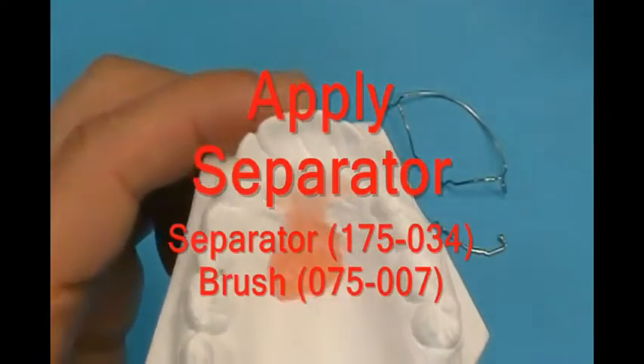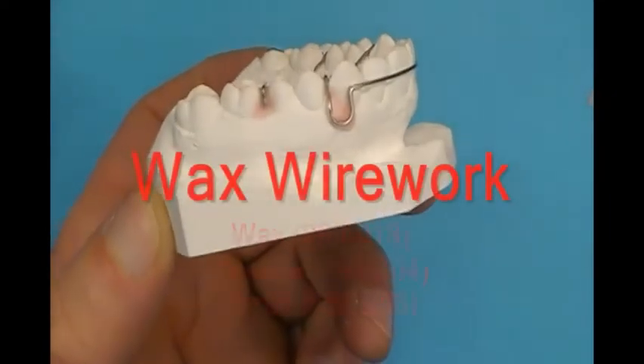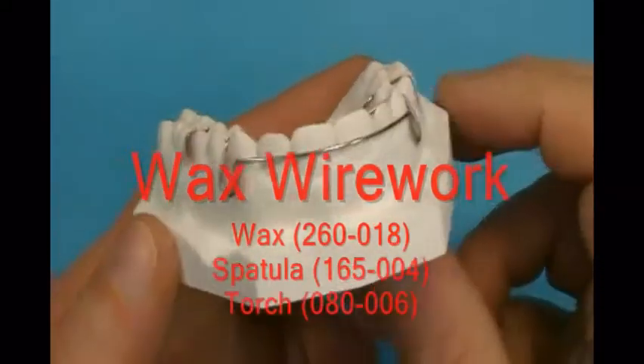Apply liquid separator to the model, except along the facial surfaces where the wires will be waxed in place. Apply wax facially over the wires to hold them to the model.